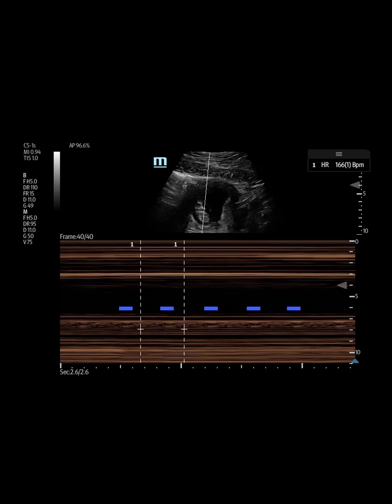To measure this, click on the measure button on the left side and hit the advanced measurements. The fetal heart rate should auto-select for you. You'll want to measure from the beginning of the wavelength to the end of the wavelength. You'll notice that the fetal heart rate is calculated for you in the upper right portion of the screen. I always try to remember to hit Save Image so you don't lose all this information.